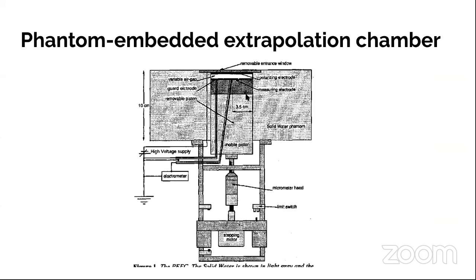So in my work, I've used solid water to measure, let's say, surface doses. For this particular top cap, instead of solid water, because with solid water the minimum thickness we could get without it breaking is about 2 millimeters, but I needed something really very thin, I replaced this solid water with Mylar with a 50 micrometer thickness.